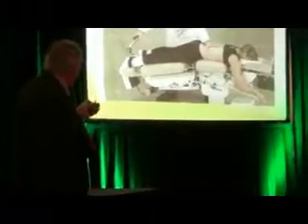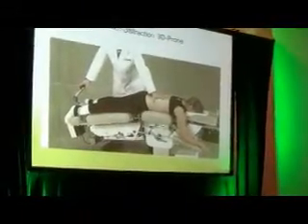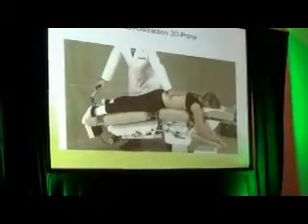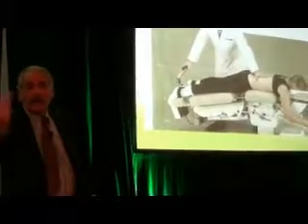Flexion distraction, you're all familiar with what it does. The principal movement is flexion, and it's classified as a traction table. Load cells to measure pressure are an example you've seen made use of in your practice. I never had much results with flexion distraction tables. For some reason, maybe it's the mechanics of the device that I developed, I get better results in this edition of my device, I think perhaps because I have a readout.